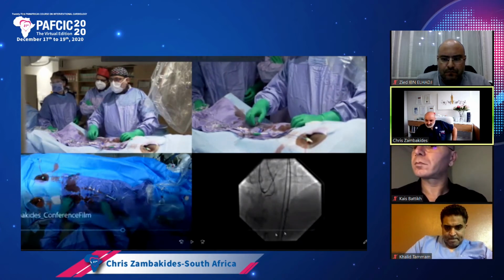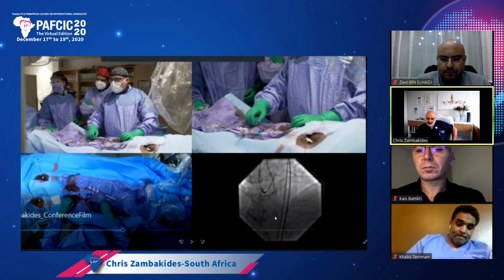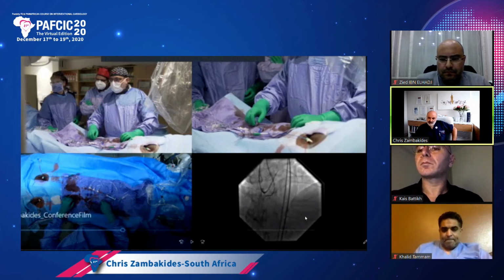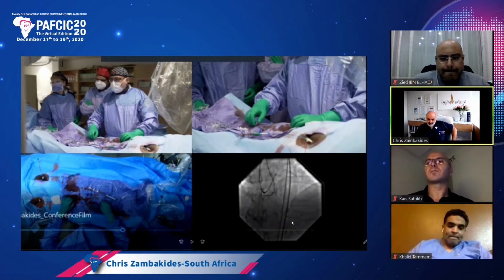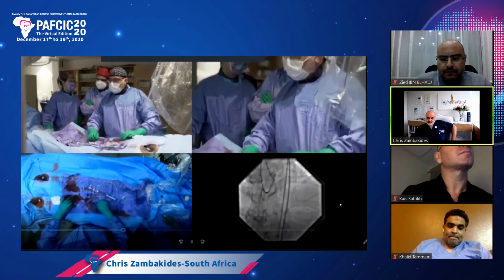The concern was this angle over here at the bottom, because you can see it's quite an acute angle. Sometimes if there's a very hard lesion that you're trying to push, you're advancing your microcatheter, you're hitting a brick wall here, and then a lot of the pressure starts building up over here, and it can sometimes rupture the septal perforator. So you really need to be careful over there. But this was the first or second time that I was using this Corsair Pro XS, and it behaved really, really well. But at the moment, I'm happy.